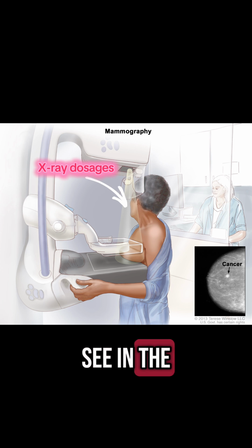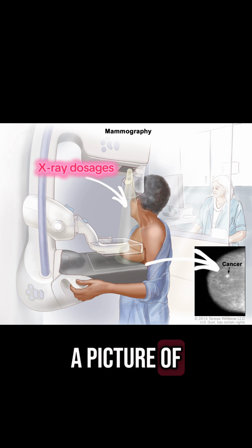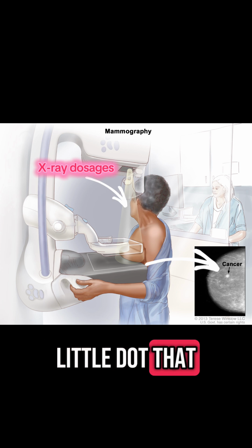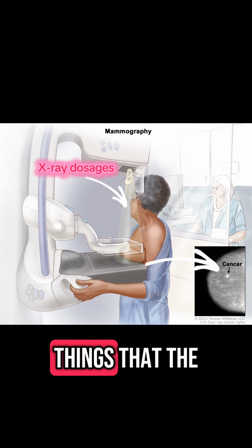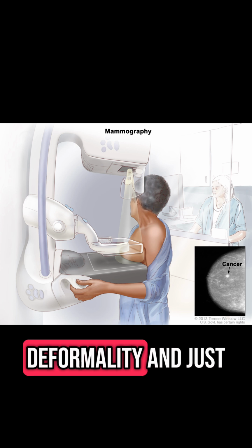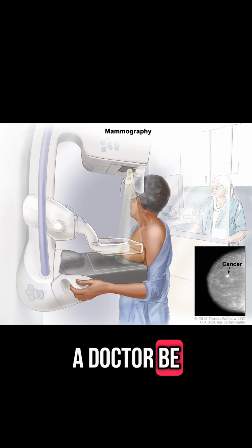You can also see in the bottom right-hand corner that there is a picture of that breast after the imaging was produced, and you can also see the little dot that is identifying the little cancer cell. Those would be the type of things that the doctor would be looking for when considering a deformality. Although to us, that may not look like a deformality and just a part of the breast tissue, those are the simple things that a doctor would be looking for.